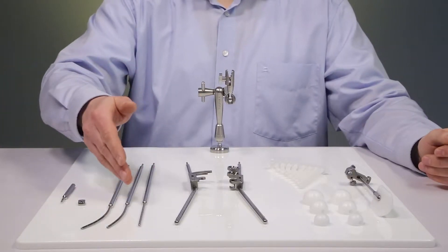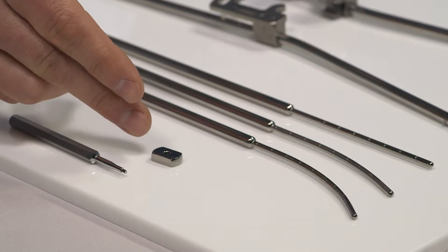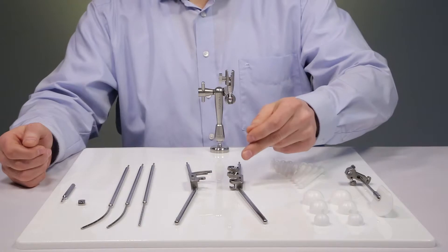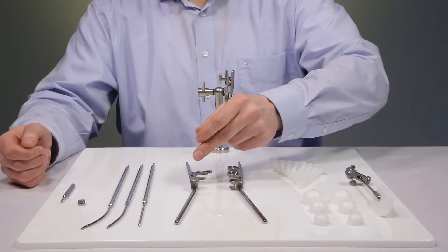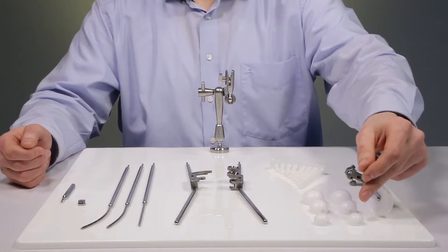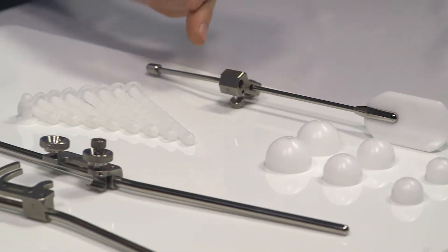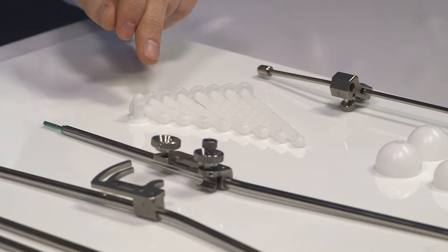The set consists of three intra-uterine tubes, a cervical stop and a corresponding Allen wrench, a right ovoid tube, a left ovoid tube, the ovoids in 2, 2.5 and 3 cm, and a recto-retractor. The Smith sleeves are available as optional items.